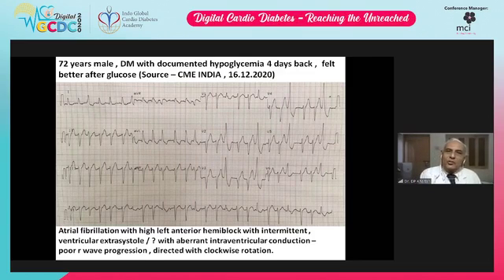This atrial fibrillation is not a good sign in diabetic patients. Whenever we see this sort of change on ECG, we become alert and try to give medical advice in a proper way. This atrial fibrillation is usually episodic, but we have to give medications to prevent the episodes, and we have to treat the patient accordingly to have good glucose control, diabetic control.